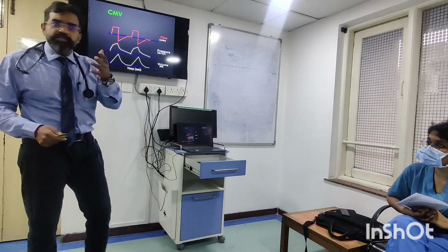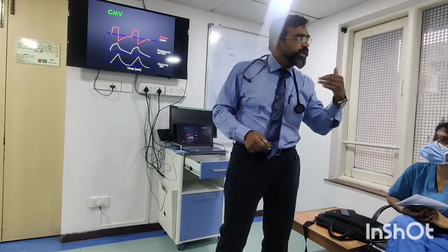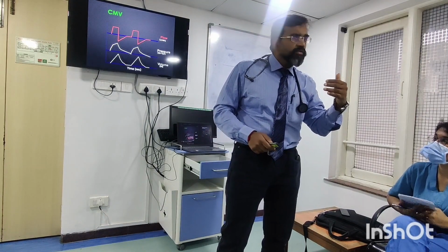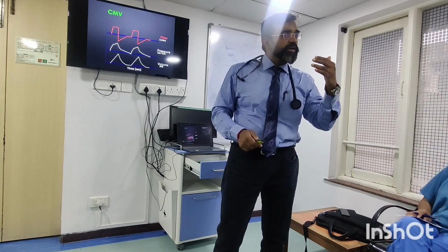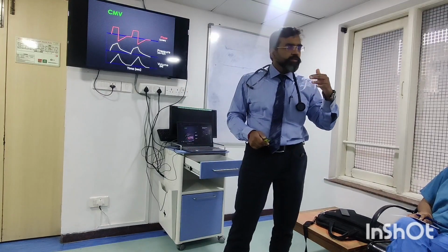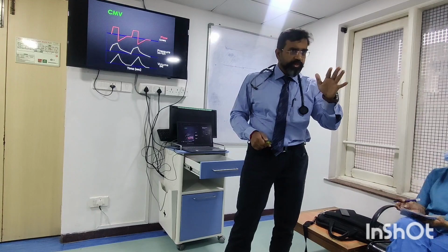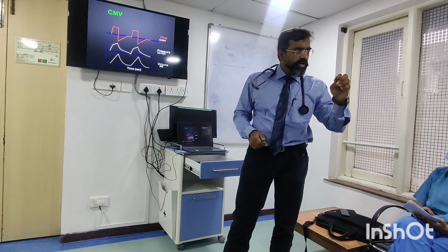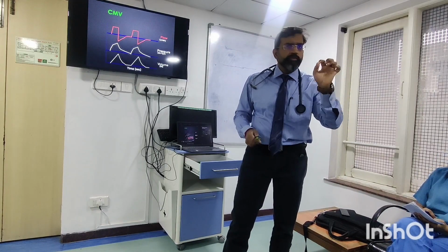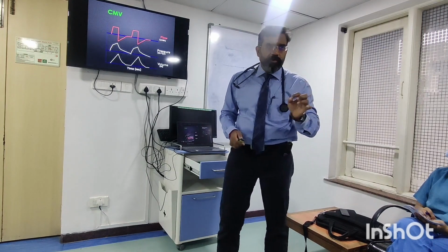We discussed what is spontaneous mode. When a patient triggers, when the patient is breathing on his own and goes into negative pressure. Right? So if the patient triggers, I must see a negative deflection. Okay? We'll come to different types of triggers and all, but it will be a deflection at the start of the pressure waveform.